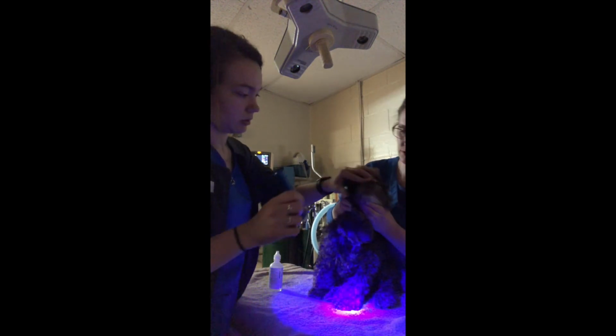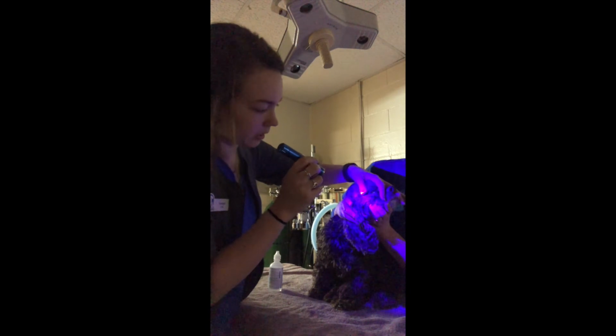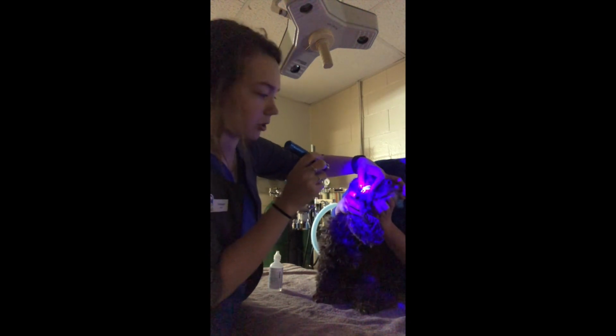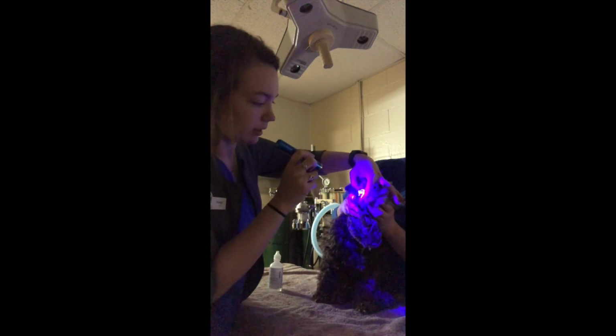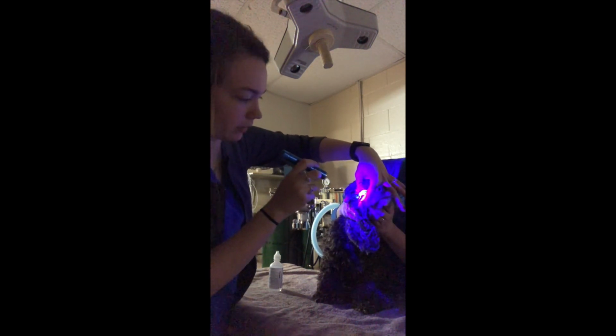Turn this way. Look over here. It's okay, Sadie. So there's no stain uptake on her eye. If there were, you would be able to see the bright green on any ulcers or any other abrasions on there.